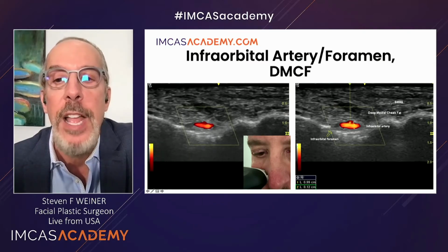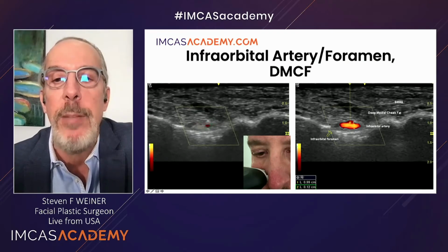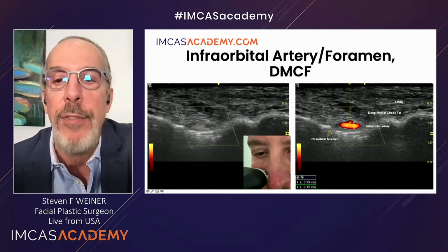And you see the SMAS. The SMAS is a constant. It's usually about 5 millimeters in the midface. It's anywhere between 3 and 5 millimeters. So that's a good reference point for all your ultrasound.